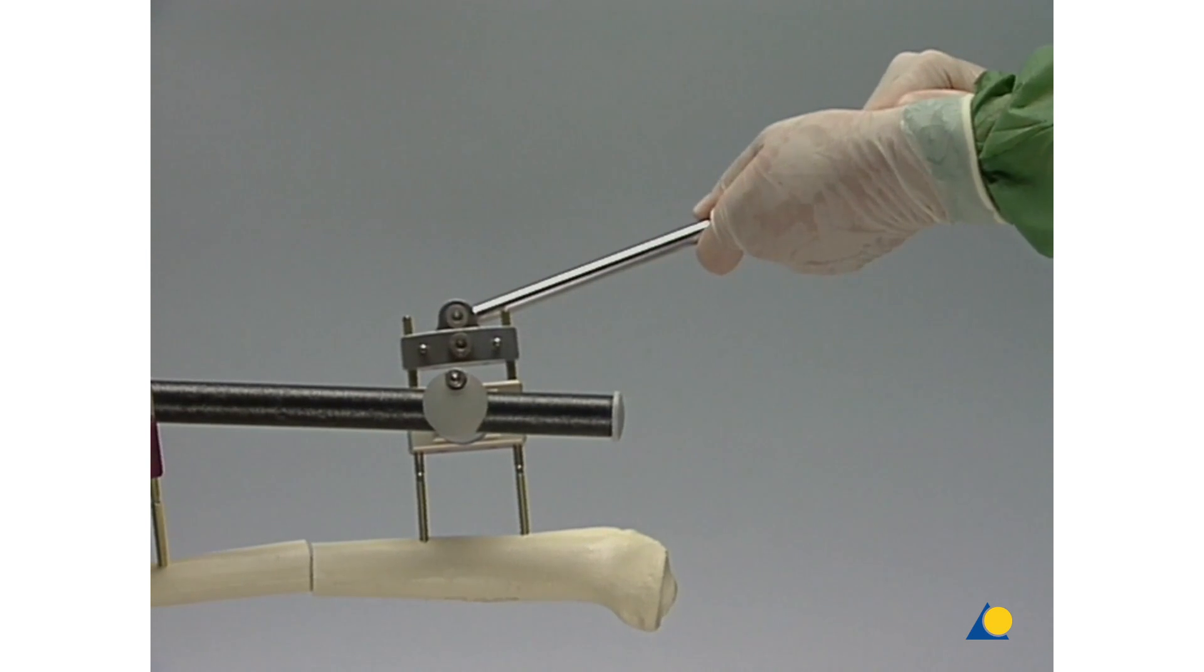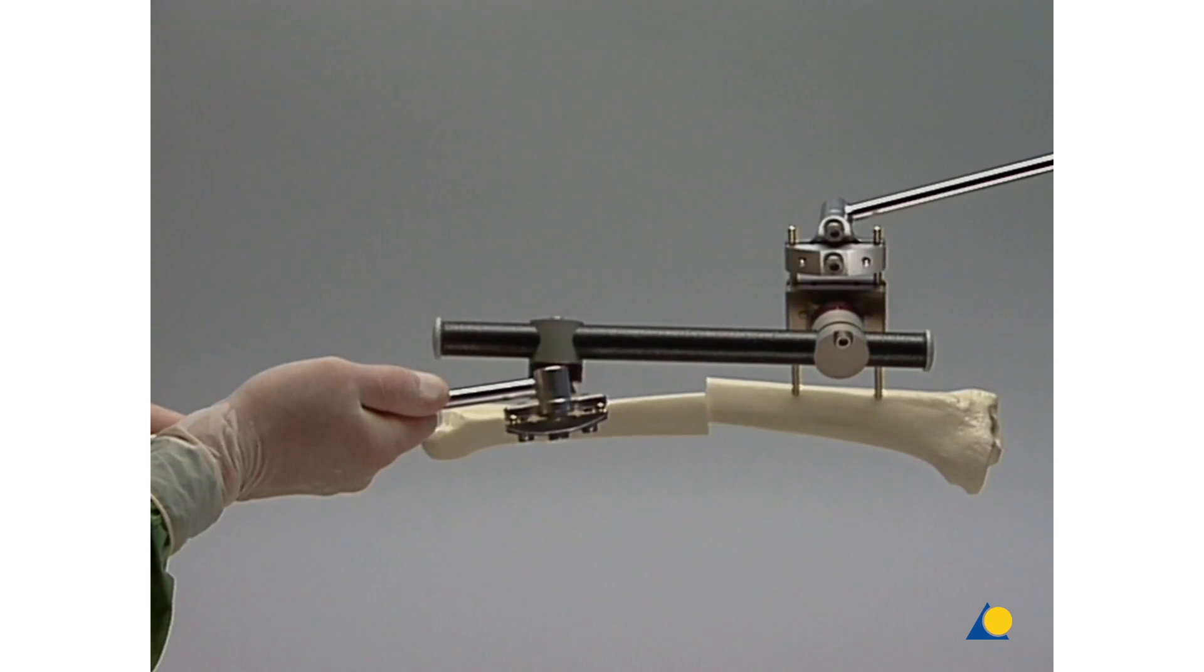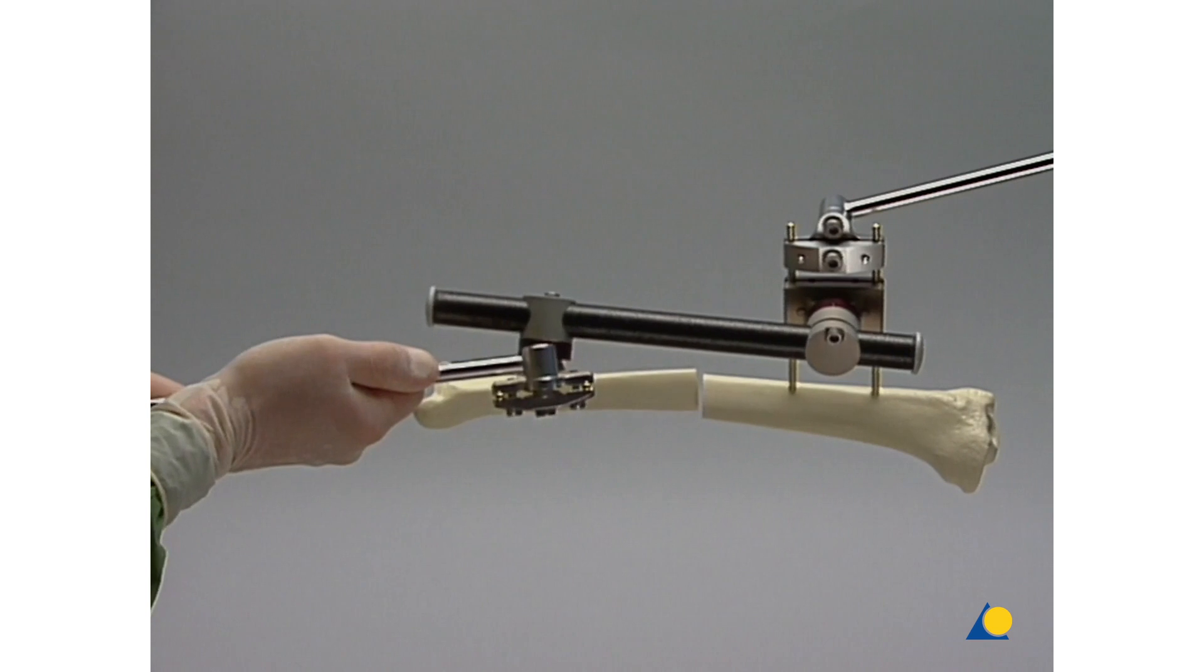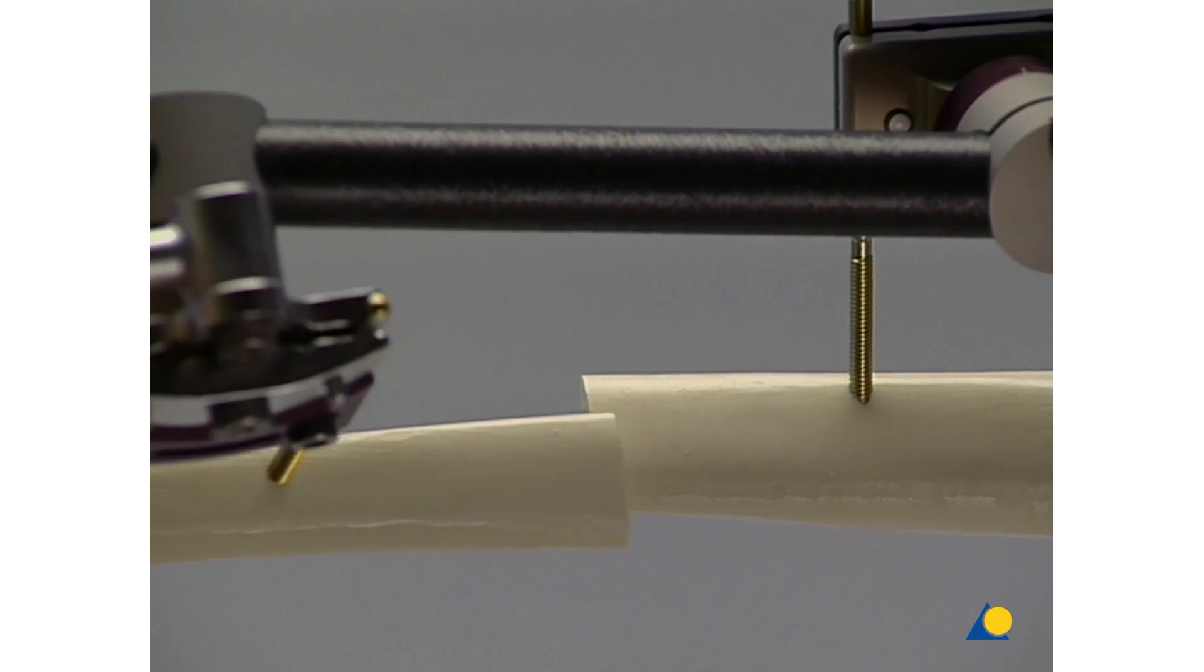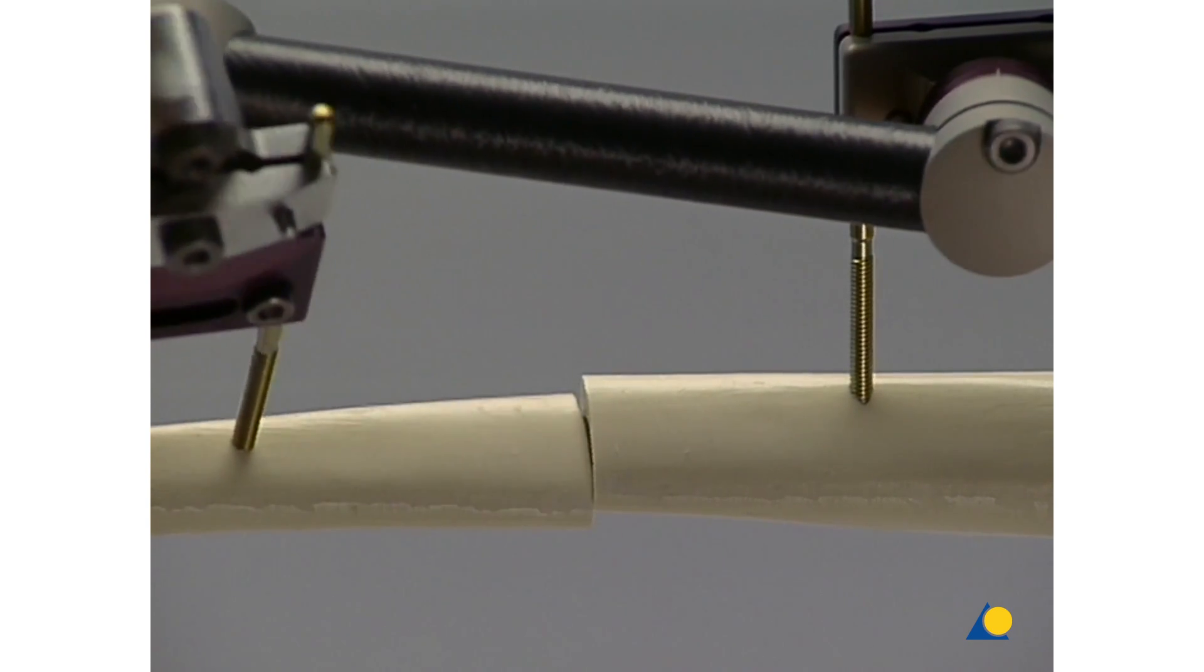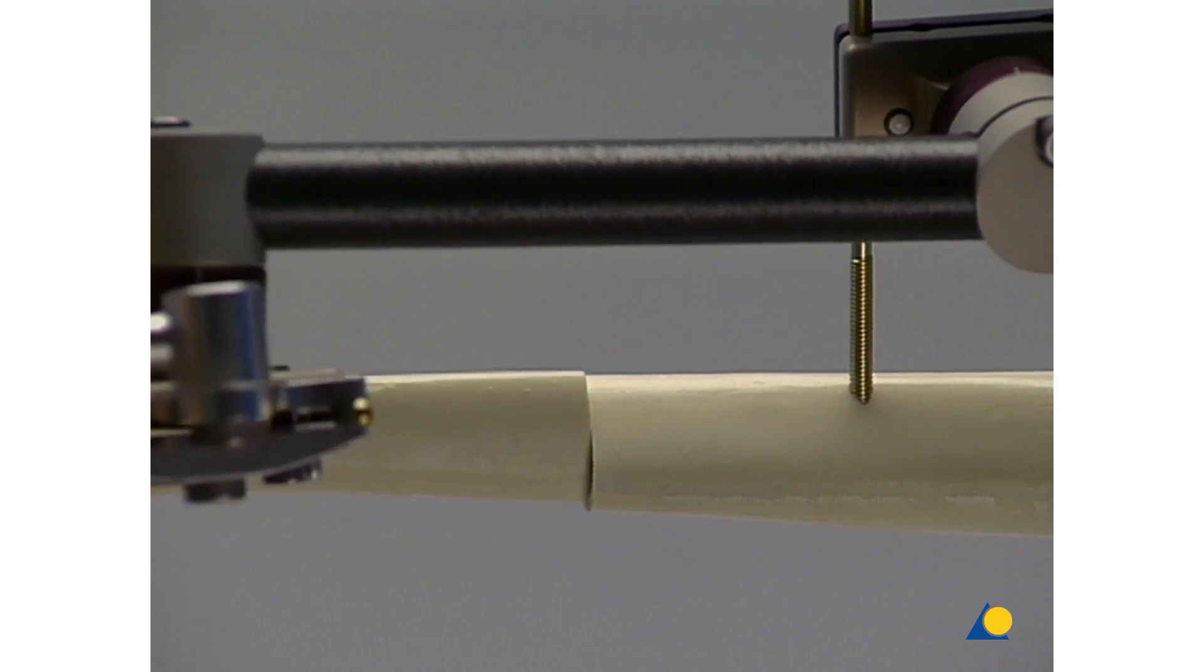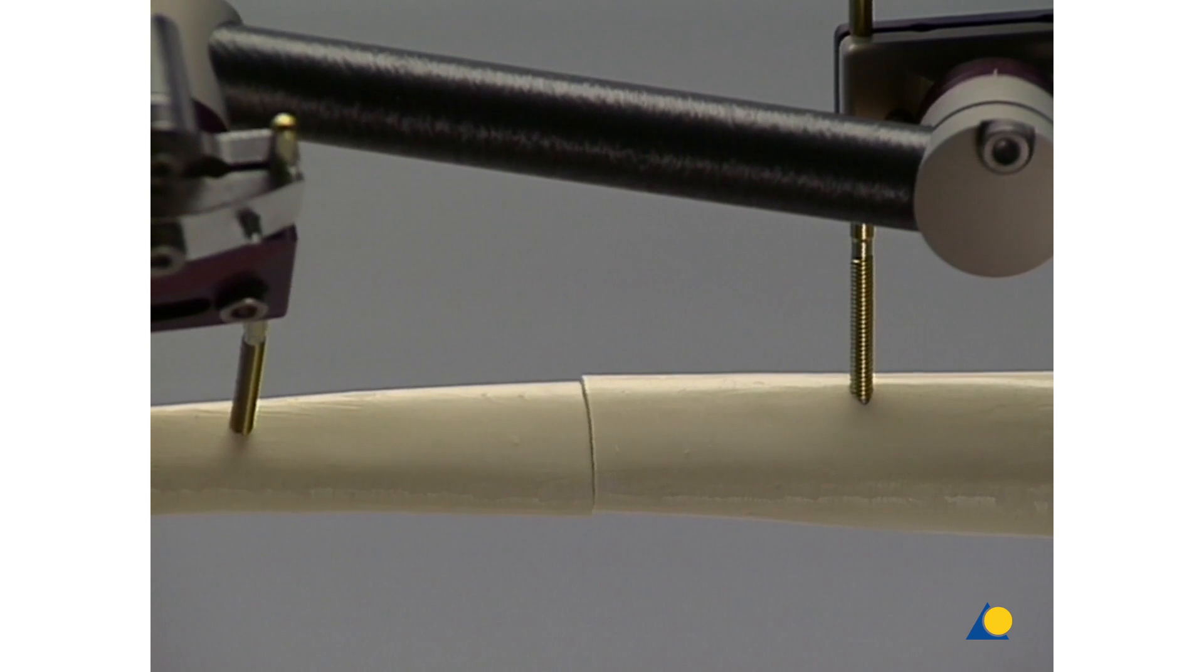It's recommended that one assistant holds his or her grip more or less still while the surgeon performs the major manipulations, in this case on the distal fragment. The system allows movements in all six degrees of freedom, which make it possible to perform a completely free and careful reposition in only a few reduction steps. Holding the reduction, the central screw in the saddle joint of both clamps and the screw in the main body of the standard clamp are tightened for final fixation.